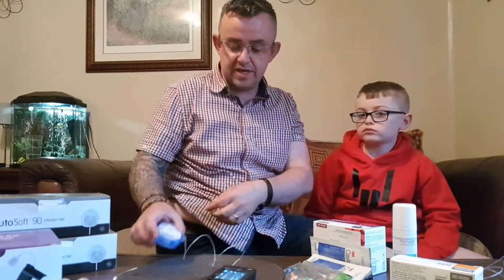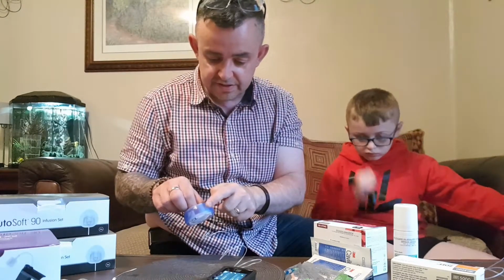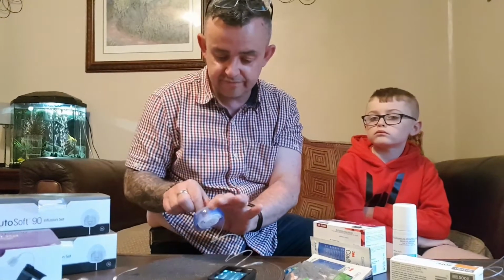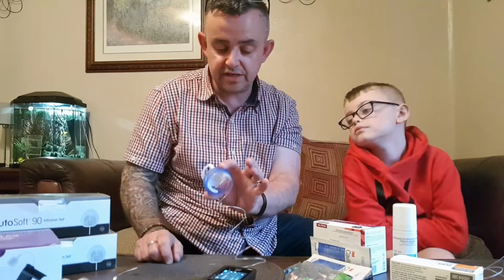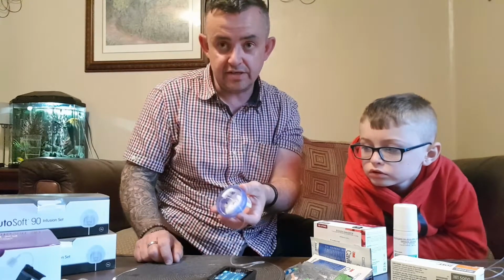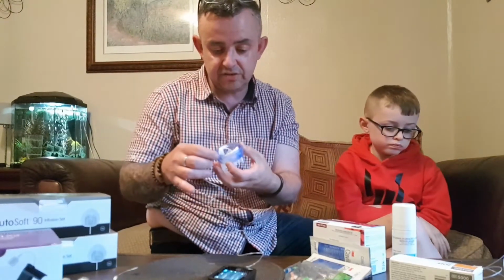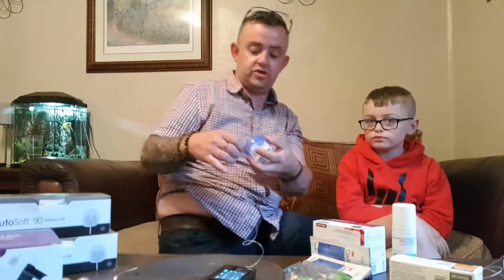So we're going to go in here. What we need to do: on here there's lines either side, and then there's dents either side. We hold it on the lines and pull back. You always hold the cannula set with the lines, and then when you go to insert it, you change to the circle. You need to find the little cutout where the tubing goes. If you look on the top, there's an arrow pointing there, so that's where the wire, or the tubing, is going to come out.